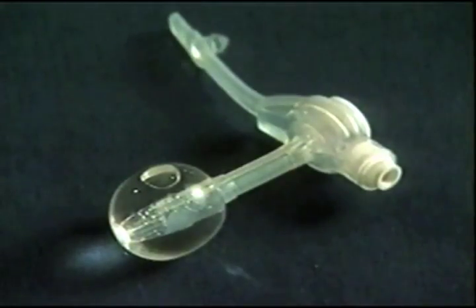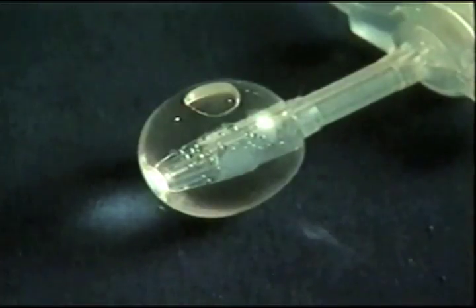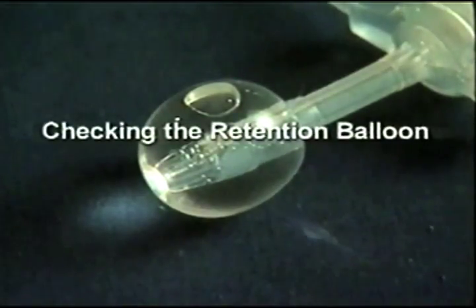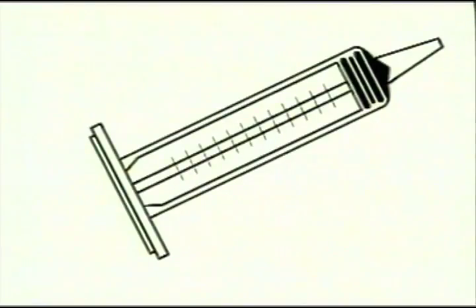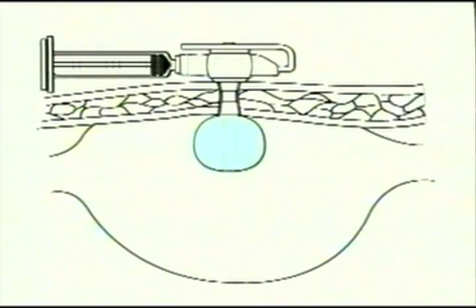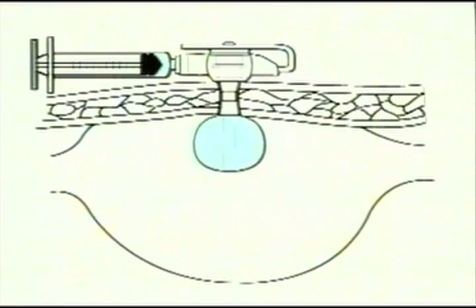The balloon is made of silicone, which can be semi-permeable to some fluids, so the balloon may change in volume over time. Your doctor may recommend that you check periodically to make sure that the retention balloon is still properly filled. It's simple to do. Take the Luer slip syringe that came with the Mickey kit and push the plunger all the way in. Now attach it to the Mickey balloon port and pull back on the plunger. If the fluid that comes into the syringe is less than the originally prescribed amount, detach the syringe, fill it up to the proper amount, and reattach it to the balloon port. Push the plunger in, and the balloon is now filled to the right amount.